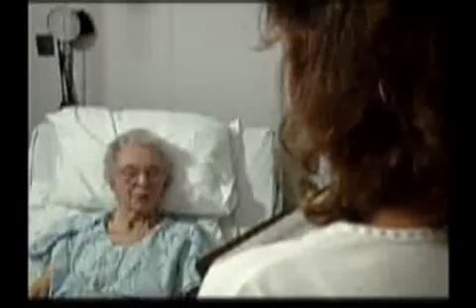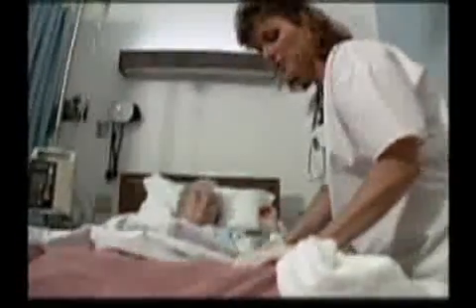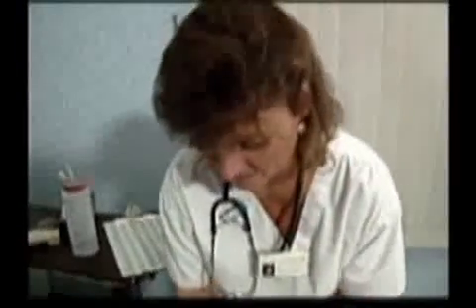If this is the case, the cardiologist must be notified promptly before the procedure. The patient's groin is shaved. The patient should be NPO — that is, should not take anything to eat or drink on the day of the procedure.